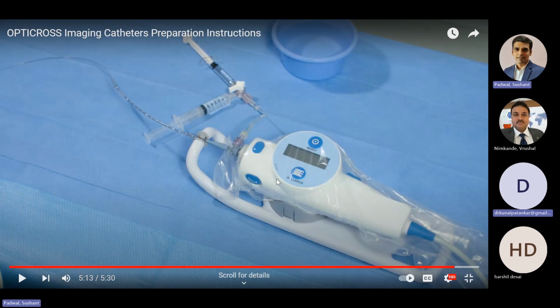Single operator. Sir, how is that possible in a sterile field? Because you have a mouse, you have a keyboard, and the monitor is so far away. Imagine I myself am doing an IVUS at my own center. It is 12 in the midnight. I have this entire setup of the sled, the transducer, and the processor, but how can I see the dot area, the EEL to EEL? Do you have a touch screen which is sterile? No. So, Sushant, you have that image viewer screen on your laptop. Just share it.